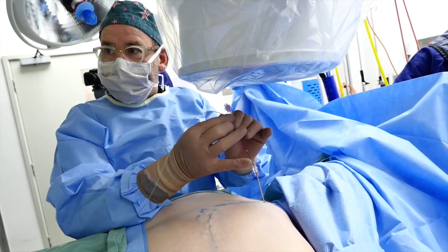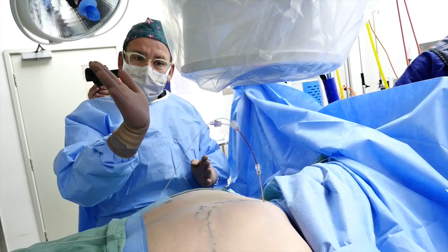We've got the leads going up and making a loop. That's just crossed back over the other one a little — I don't want to leave them in there crossed. I'm just going to uncross the lead a bit when we tie down. Okay, let's go with the next one.